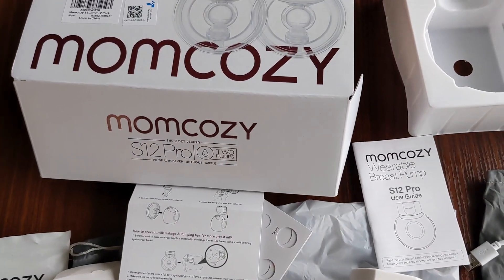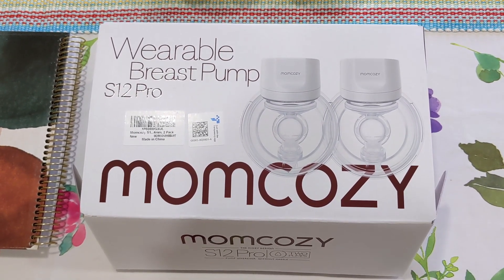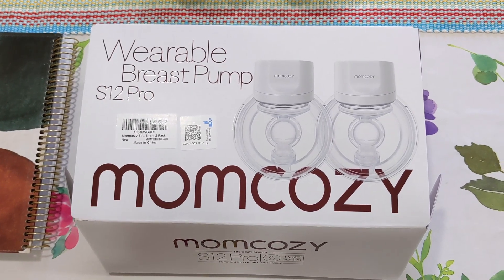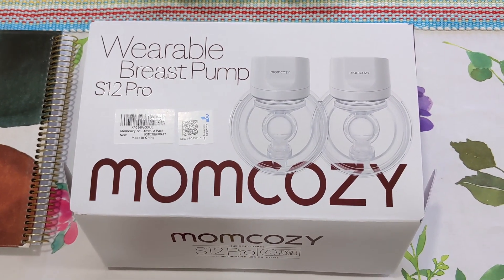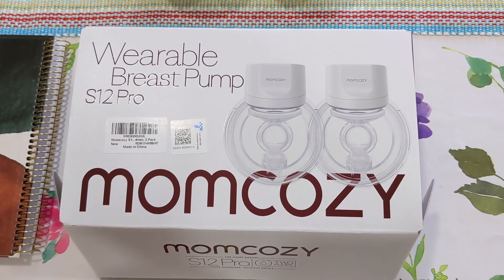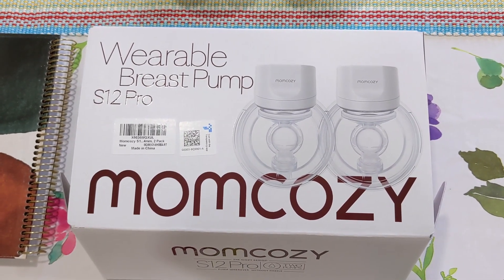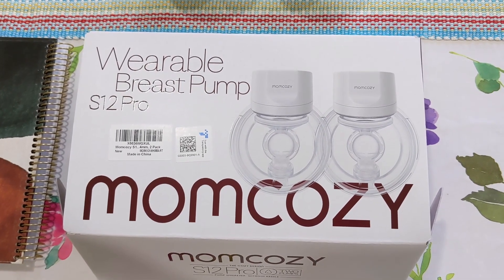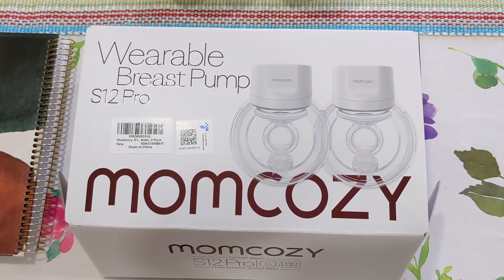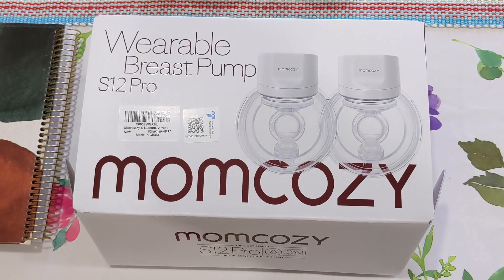I have been using the Mom Cozy wearable breast pump S12 Pro for two weeks now and so far I'm really pleased with them. I have another set covered by my insurance — I picked the Spectra S2 Plus, the pink one — but it's not rechargeable, so every time you use it you have to stay close to an outlet. For the last two weeks I've been using the Mom Cozy wearable breast pumps exclusively and I'm really pleased with how they work.